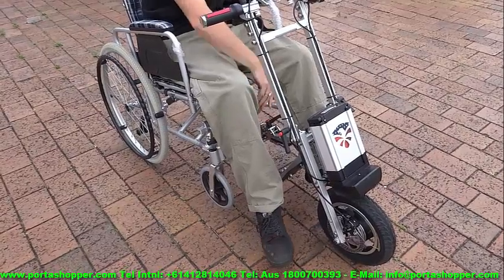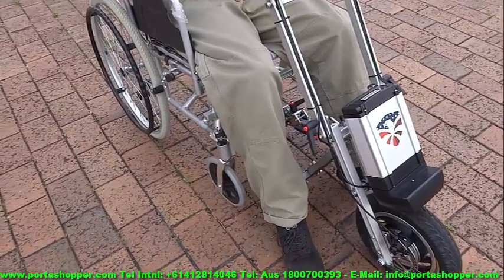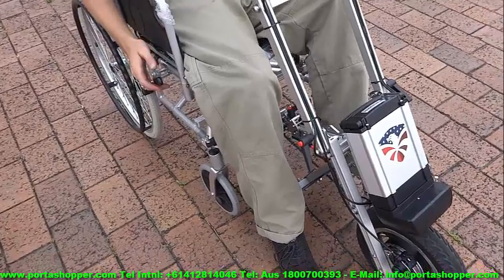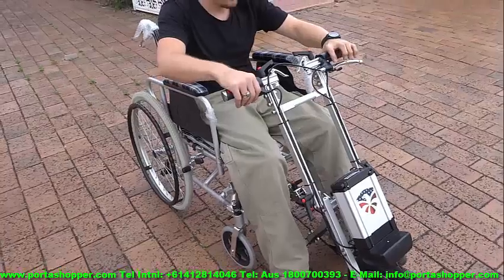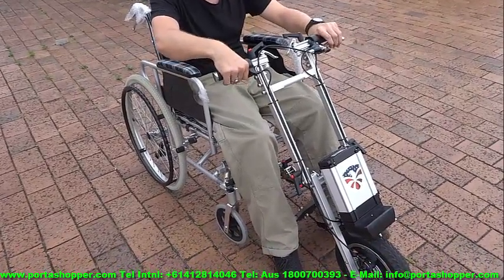Remember to pull the brake lever of the Portawheel in sharply and keep it engaged to make it easier to screw the safety bolt in. Remember that once it's hooked up, you can actually let go of the brake, but holding the brake in just relieves the tension to make it easier. Disengaging is very easy, and you simply follow the steps in reverse.